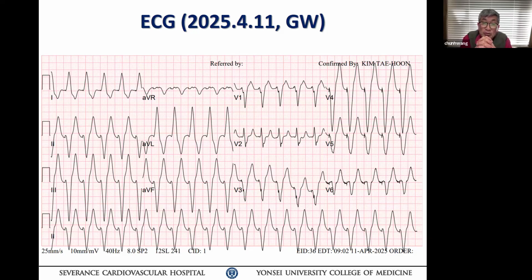So you have to open the differential diagnosis. One could be that the pacemaker is at upper rate because it is sensing atrial activity at or faster than the maximum rate, or it is sensing retrograde P, the so-called PMT. But modern pacemakers, as you know, mostly have a PMT algorithm written in, so seldom does it sustain more than 10 beats.